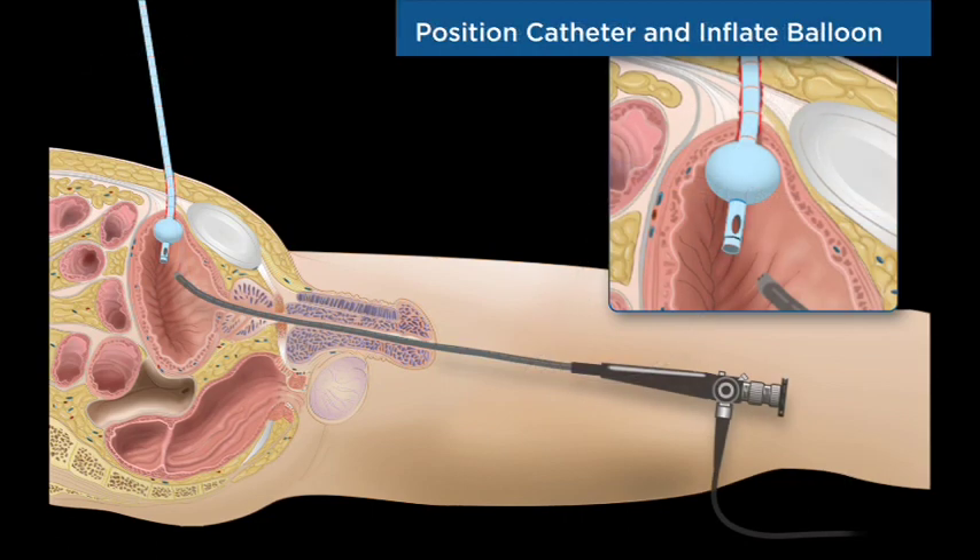A flexible cystoscope confirms balloon deployment in the bladder. The precise nature of the surgical cut ensures correct positioning of the catheter balloon at the bladder dome. The Swan 18 French suprapubic catheter is now properly positioned and ready for use.